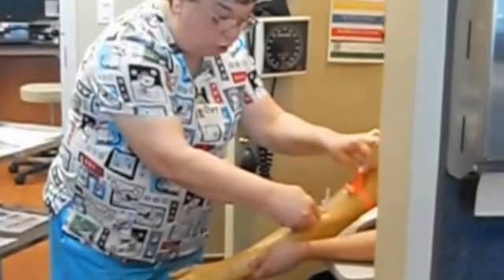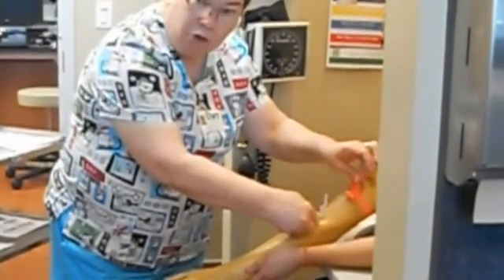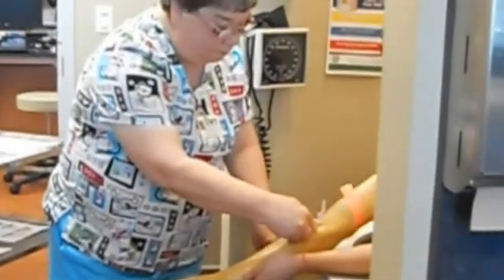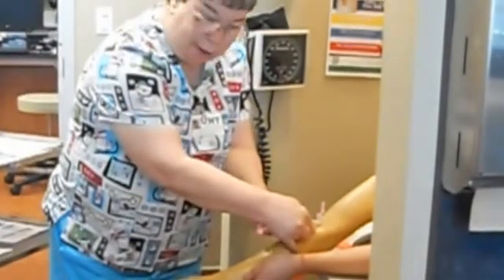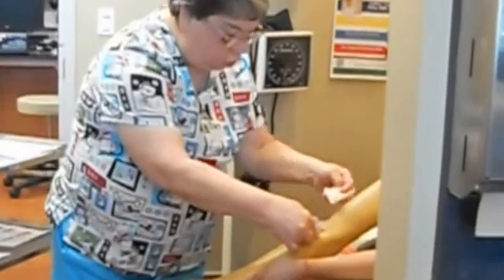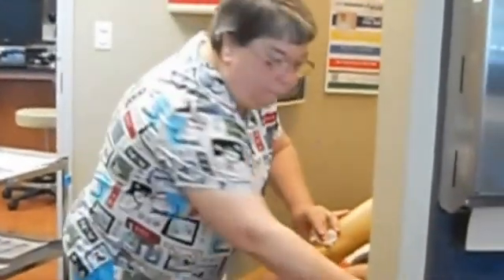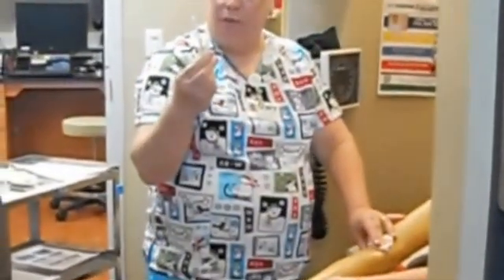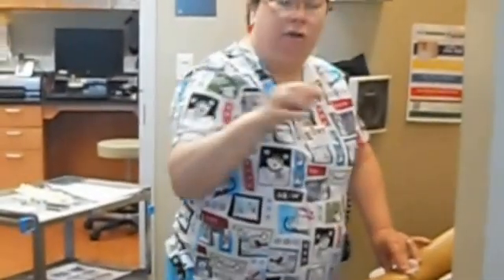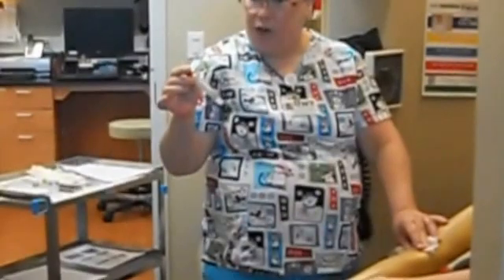Then tourniquets never stay on the arm more than 1 minute, no more than 2 minutes. 2 minutes at the max. Undo it, pull the tube out, pull this back where you can see. Get your gauze, cover it, and come out. Take your needle and secure it. This whole thing gets thrown out, and you have your tube of blood. Okay? Any questions?